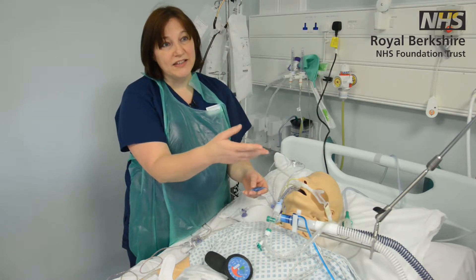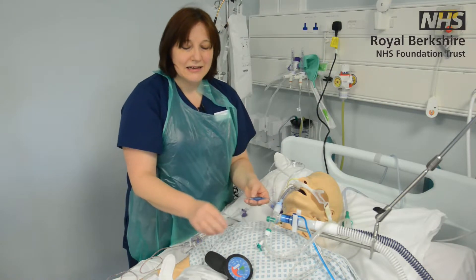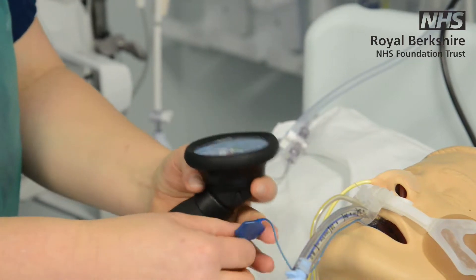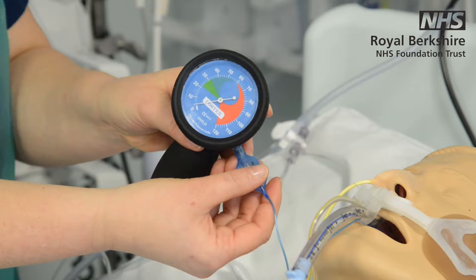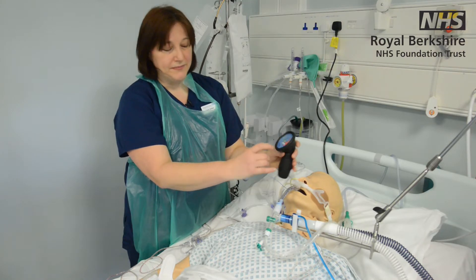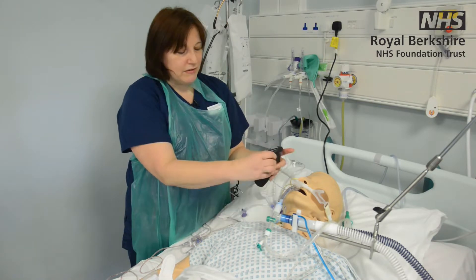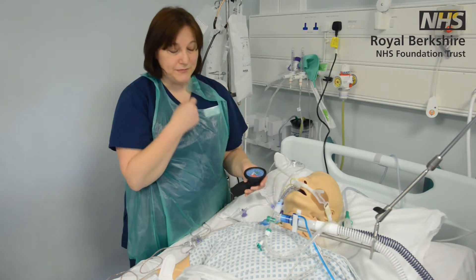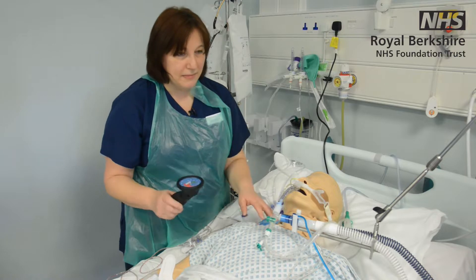New technology and new ventilators might have an automatic cuff pressure manometer that comes up on your ventilator screen, but if you don't have that, most of us use a handheld cuff pressure manometer. You simply attach it to the cuff and make sure the pressure is in the green zone, which is between 20 and 30 centimetres of water. If it's too low you may hear air escaping — we call that a cuff leak. We don't want it too high either, to avoid pressure damage in the larynx. We tend to check this four-hourly, but follow local guidelines.